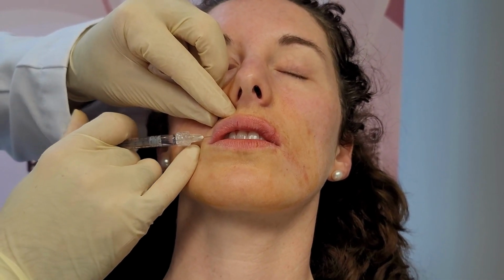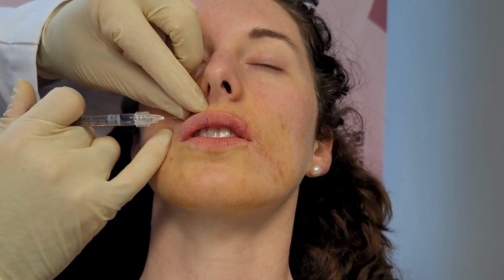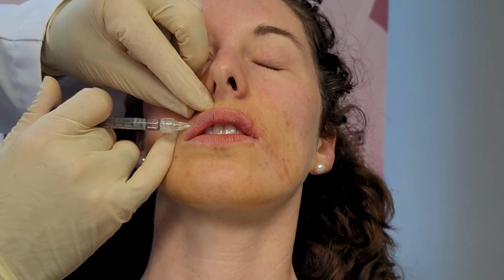And this goes slowly, but before you know it, you find the product tube getting smaller and smaller. So you know you've transferred the product into the lip. Usually one tube for both upper and lower is what I usually do. With fillers you can always add. You don't want to overfill. And usually one tube looks natural and is sufficient.